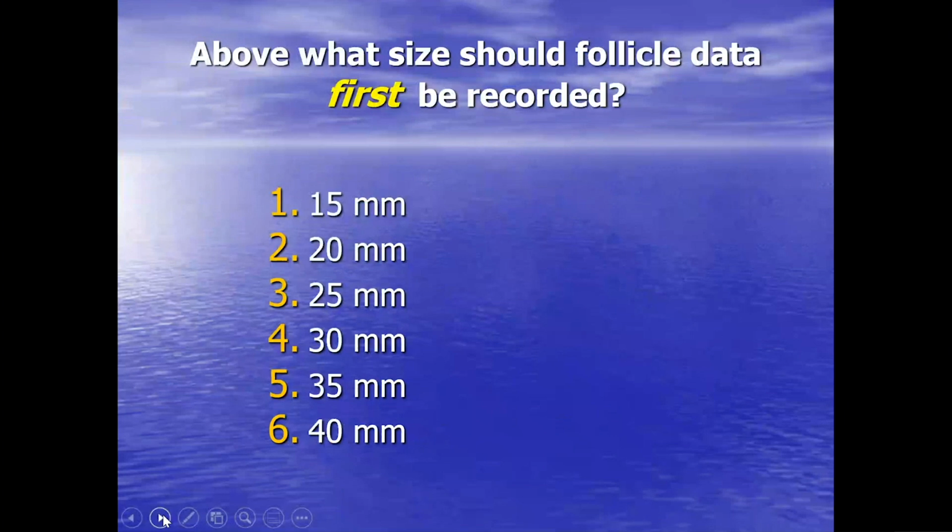But if you're watching this, as I say, as a pre-recorded session, which I think it's all going to be, you should be able to pause it now and have a think about this if you want a little bit more time. So I put here some measurements: 15 millimeters, 20, 25, 30, 35, or 40. When do you think you should first record the follicle size? Well, there isn't really a right or wrong answer. If any of you are struggling to think, oh, I don't want to say anything, I want to get the answer right, let me reassure you, there isn't a right or wrong answer.